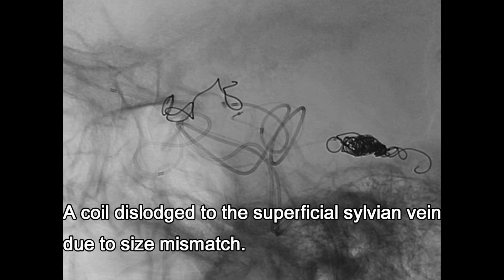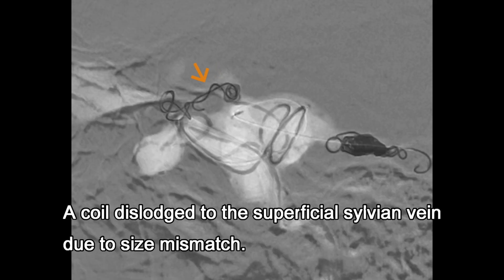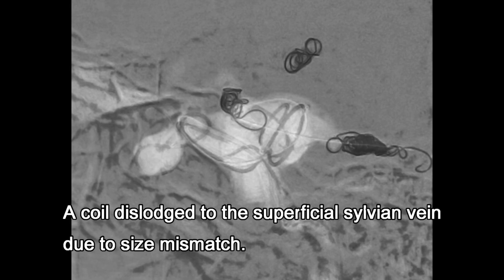During embolization, a coil dislodged from the isthmus of the sphenoparietal vein to the superficial sylvian vein due to size mismatch.